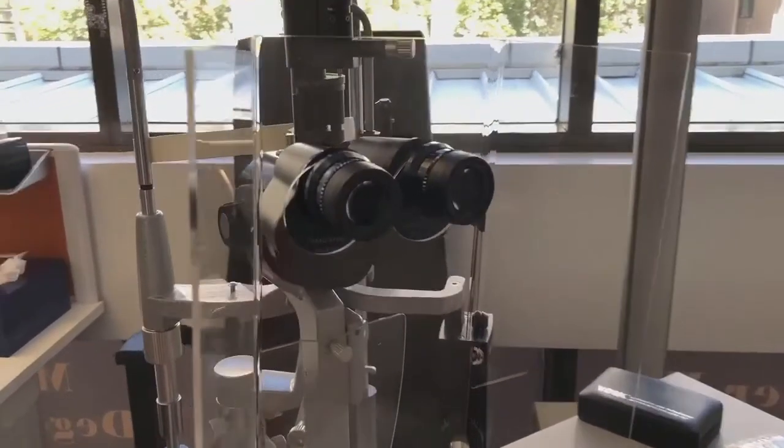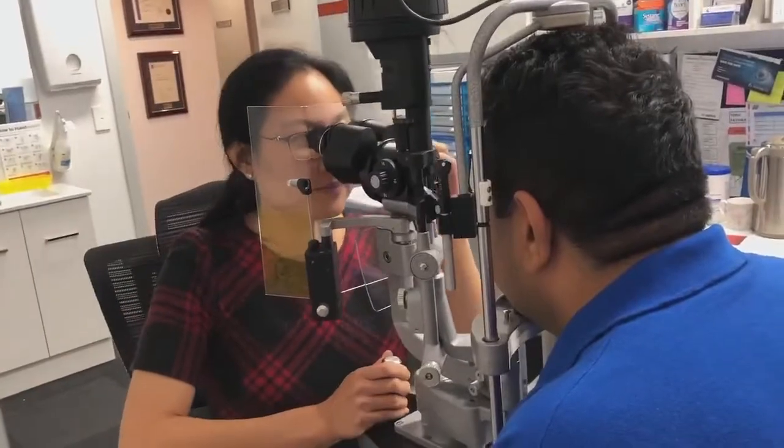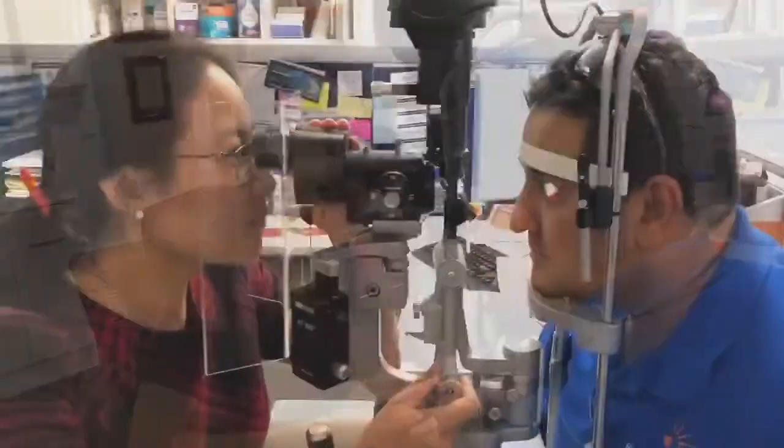The universal design suits most Haag-Streit, Keeler, Zeiss, CSO, Topcon and other slit lamps.